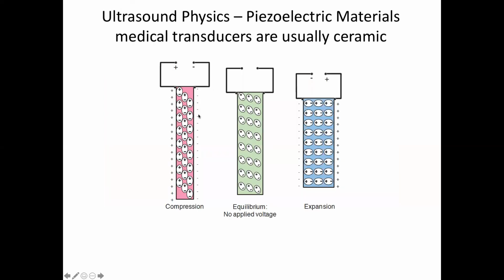Yeah, give it lower frequency. Yes, you can do that with a single device. So if you're not seeing stuff at the depth you want to see, you just drop the frequency, and then stuff comes into view that's deeper. Yeah, exactly.